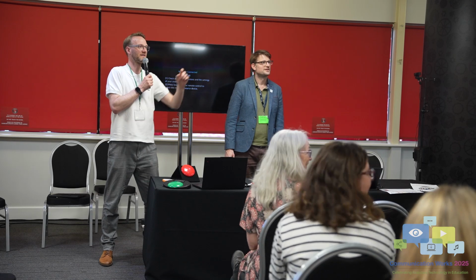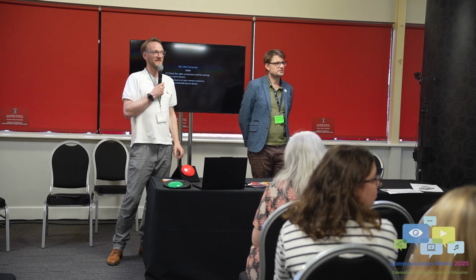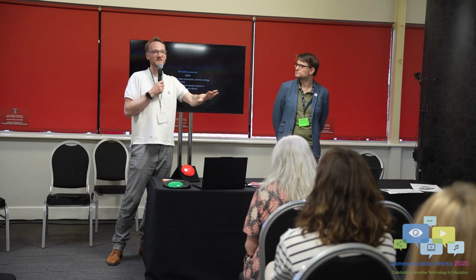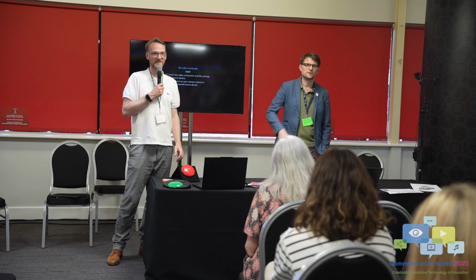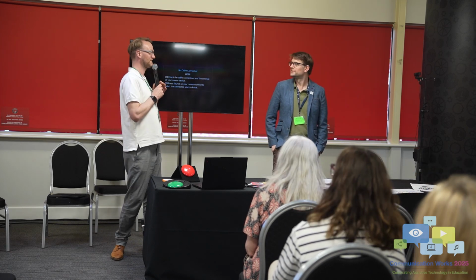Well, I'm just going to add that we put tactile identifiers on ours as well. You can change the surface of the switch and put tactile identifiers on, particularly for children with visual impairments, who might be feeling it and can identify a different switch. That was going to be my question: how do you support switch development for students with visual impairment?